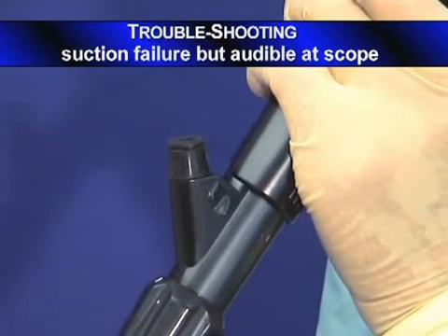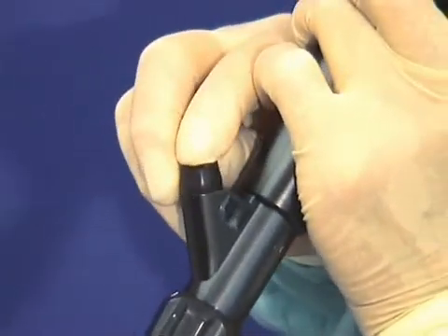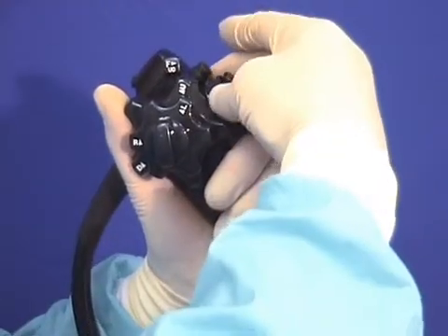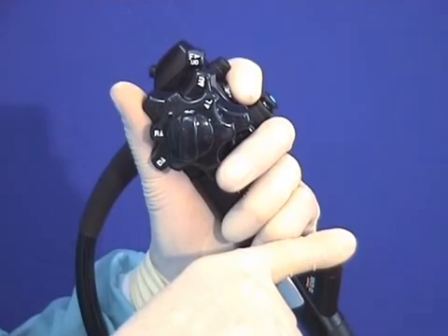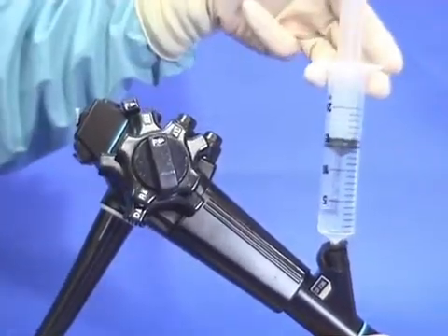If suction fails but suction is audible at the scope, release the biopsy cap to free any mucosal suction bleb. Take out the suction valve and try occluding the hole with a finger, which should free any debris in the channel. Next, take a 20cc syringe and flush water down into the colon, which should clear the channel.